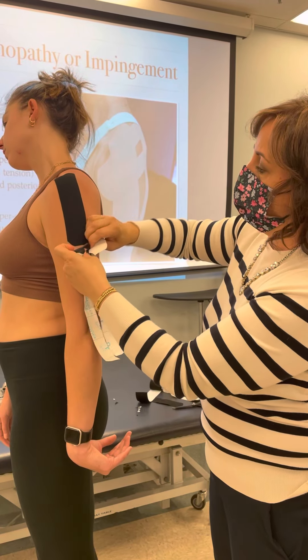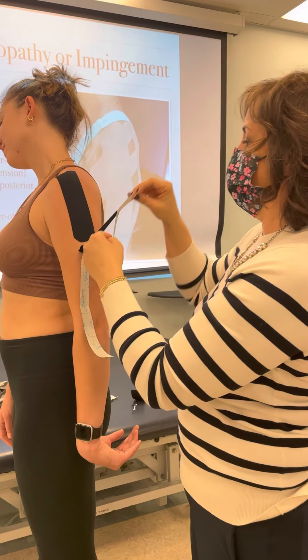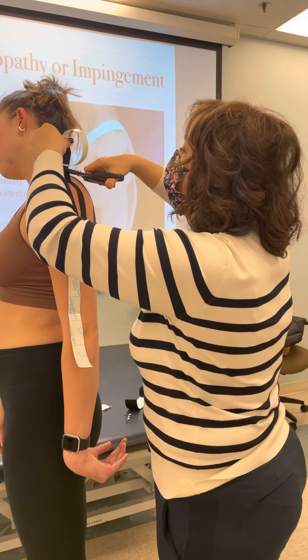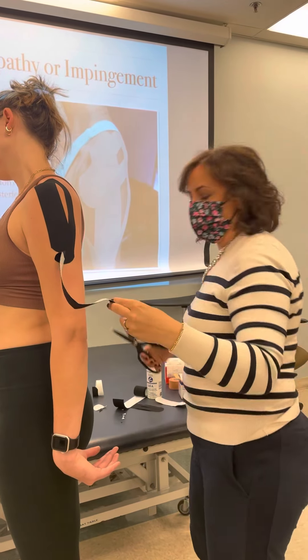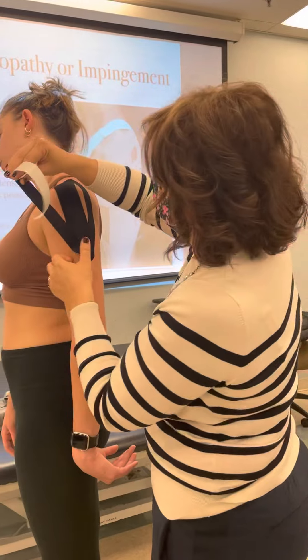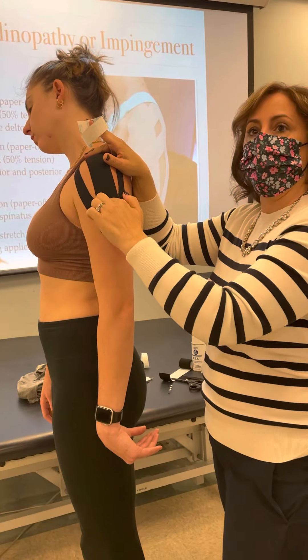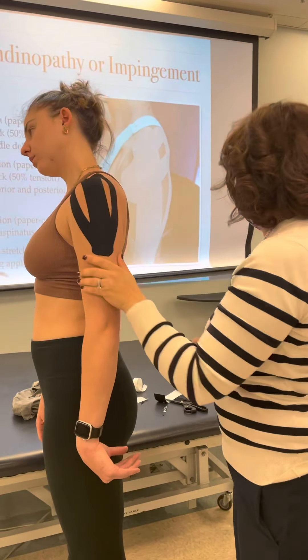Let's say we're trying to support her muscle. I'm showing that if this area is pretty small and narrow — like it was on this patient — I could split the strip so that I'm hugging through here. I made it just a hair long, so I'll round that and pre-cut it. The second piece got layered below the first piece, so I didn't lay it directly on top — otherwise it would just pop right off. Make sure to give it a nice little rub.